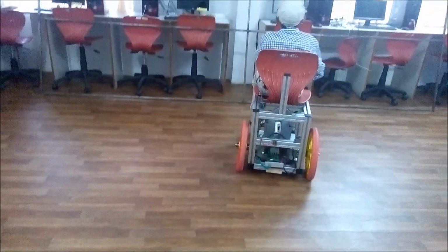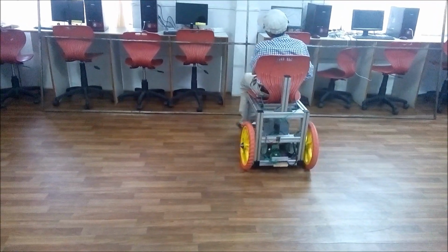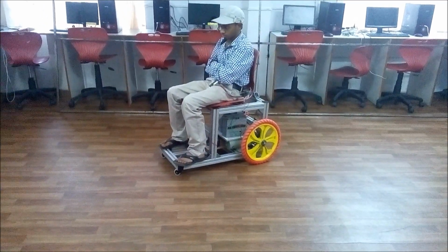We are continuing our research to implement a head gesture sensor to use our wheelchair in very high-end applications like paralyzed people, where they cannot even move their fingers.